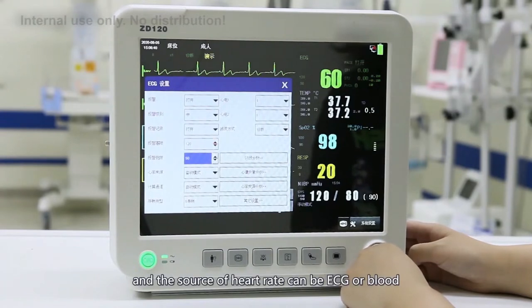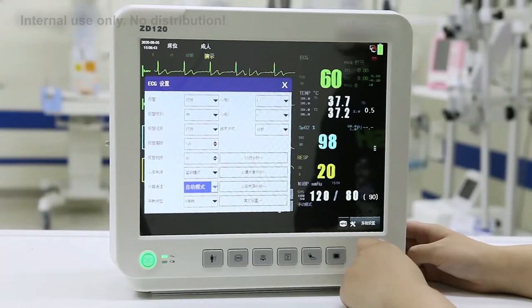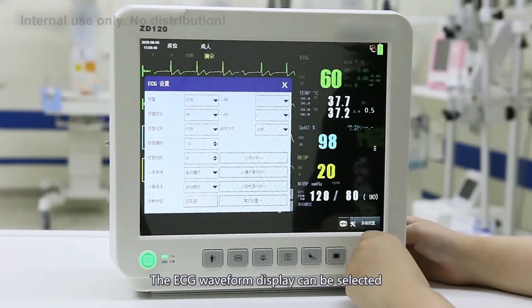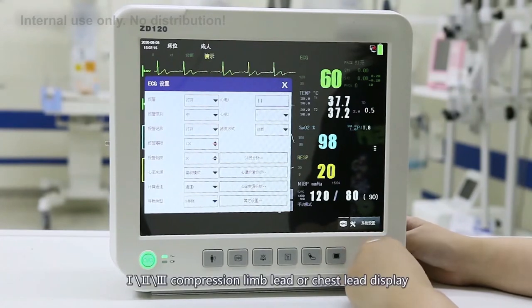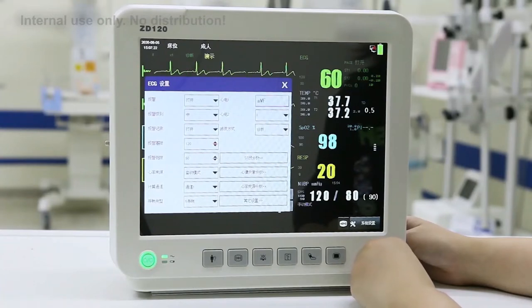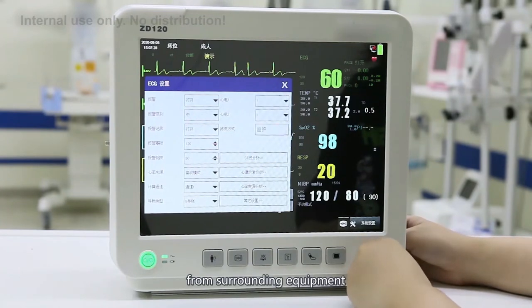The source of the heart rate can be ECG or blood oxygen probe. Below is the lead selection — you can choose 3-lead or 5-lead. The ECG waveform display can be selected according to different leads: lead I, II, III, augmented limb lead, or chest lead, depending on the doctor's preference. The filter is selected according to the external environment to avoid electromagnetic interference from surrounding equipment.